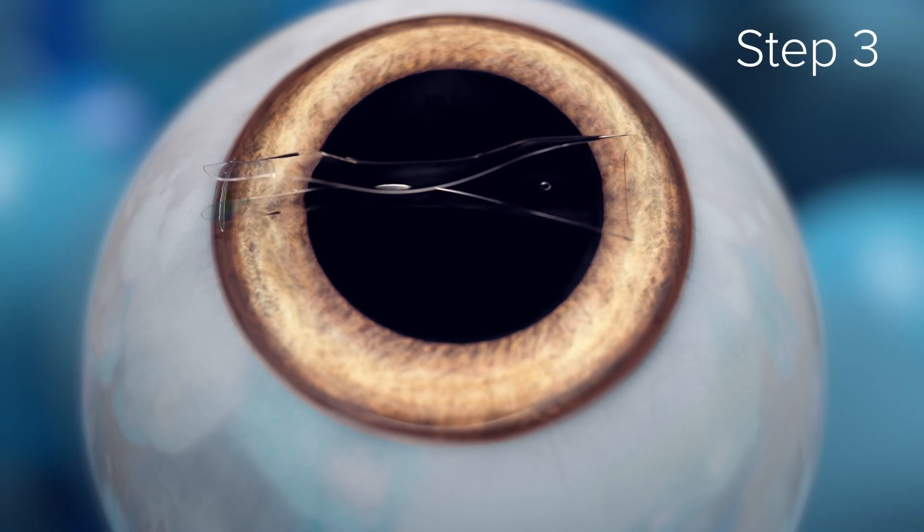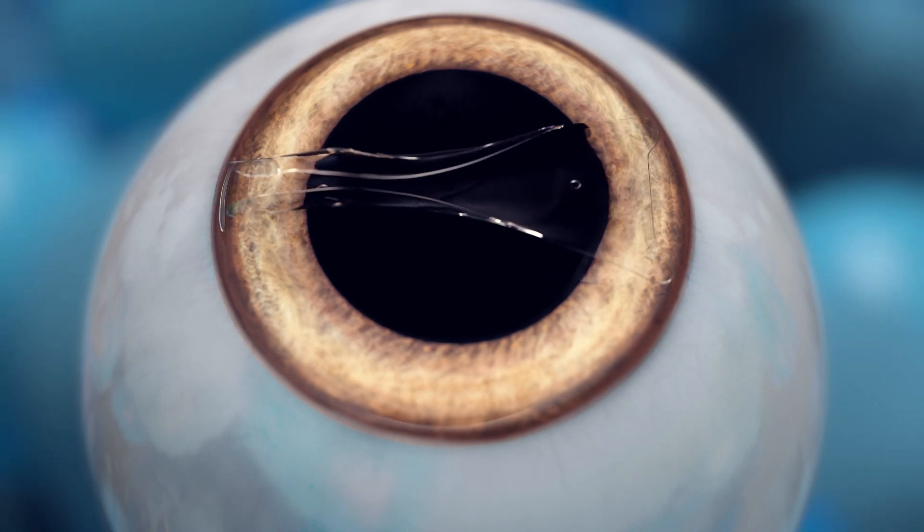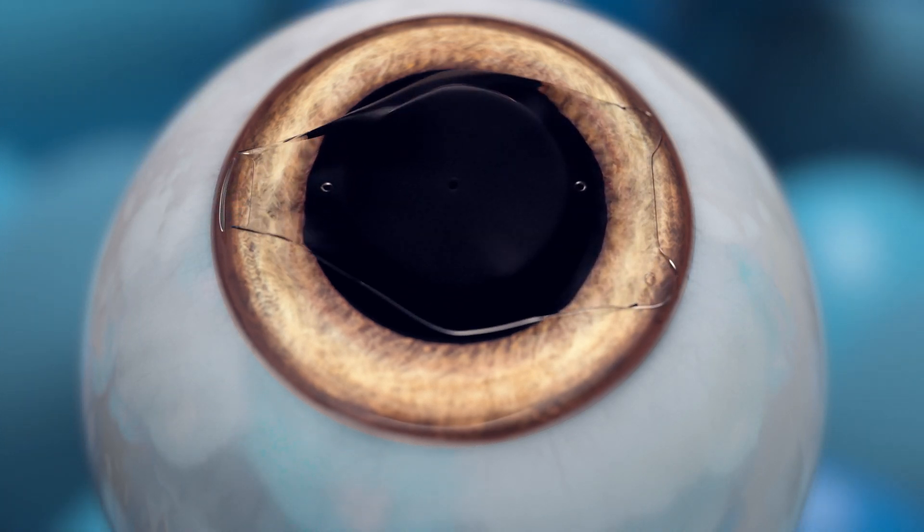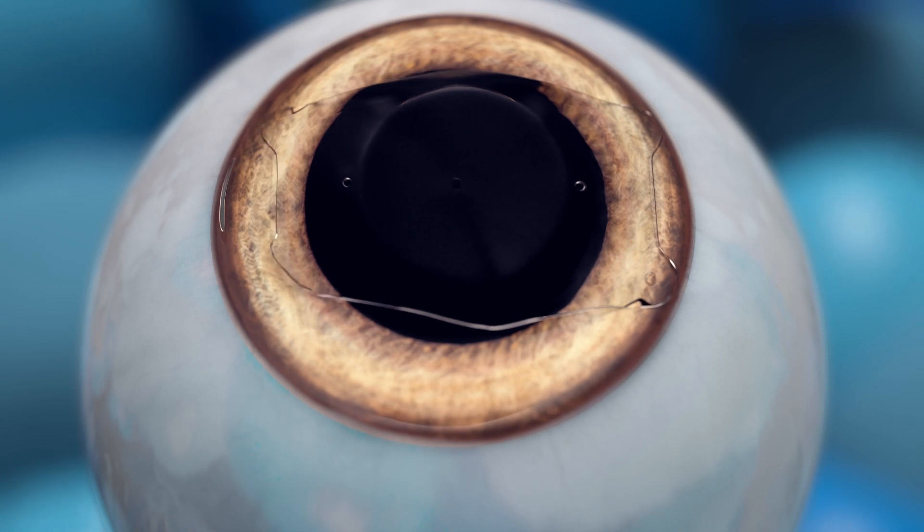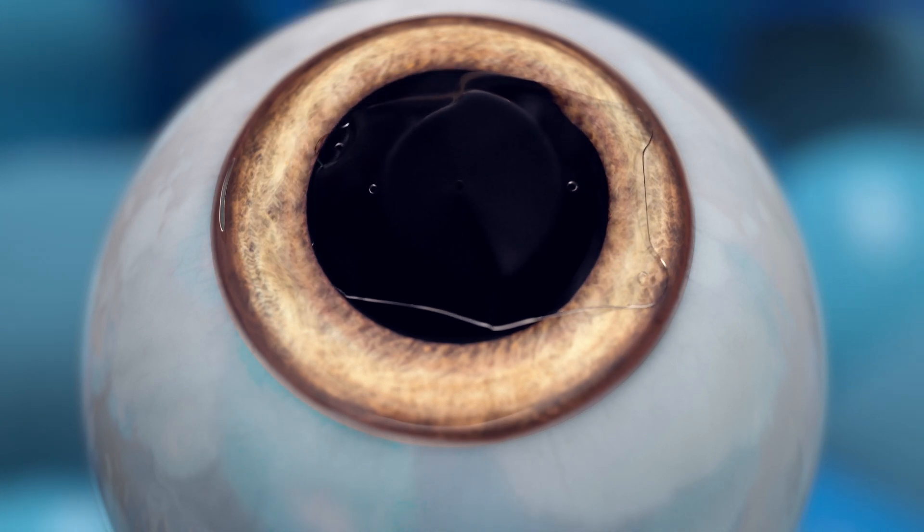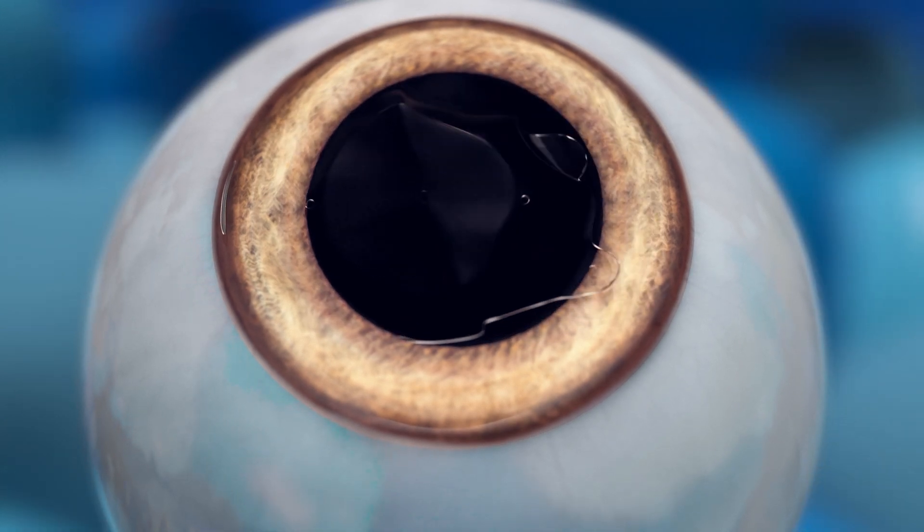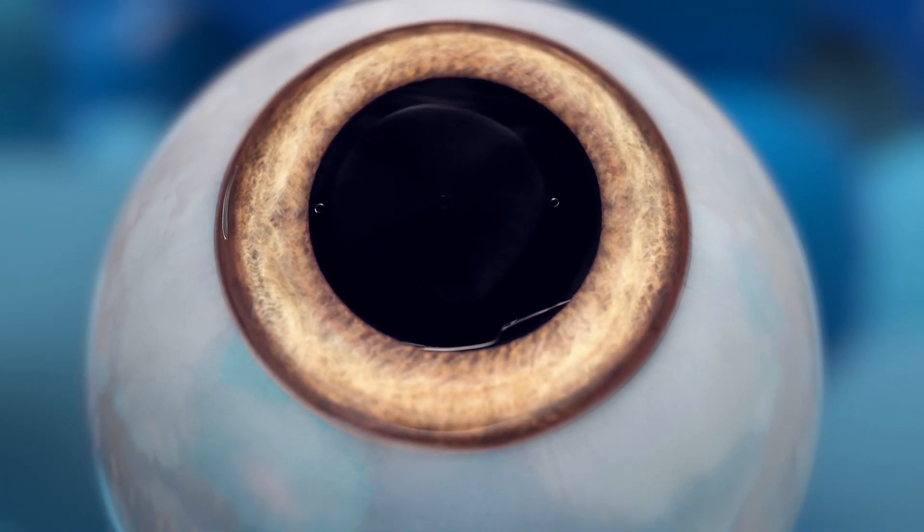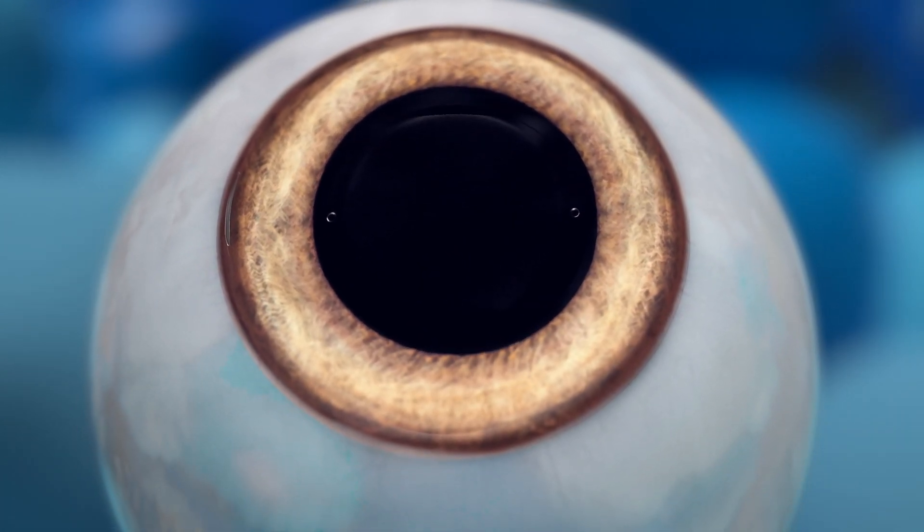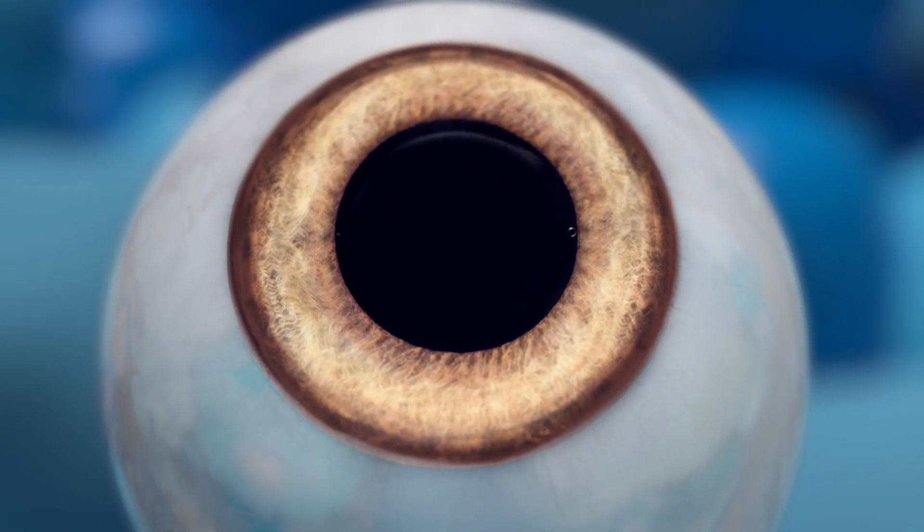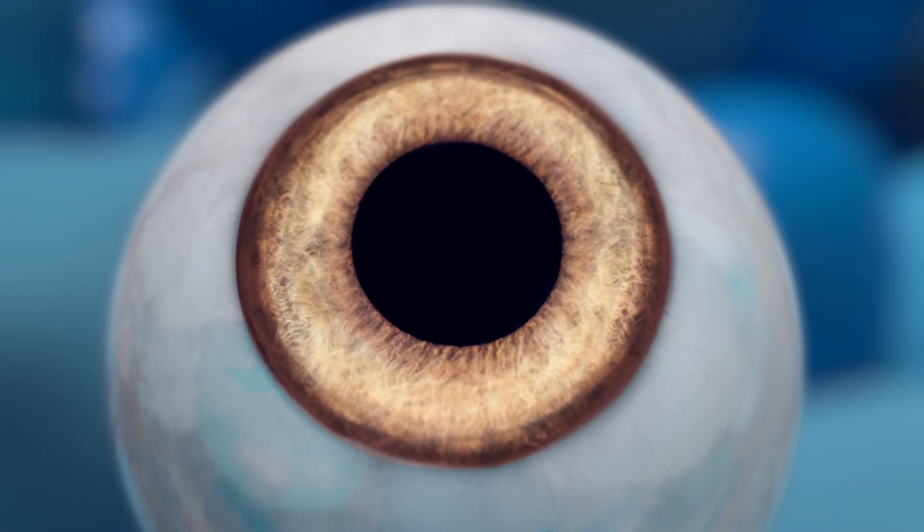Step three, once EVO is inserted, the doctor will make any necessary adjustments to ensure its proper positioning in the eye, securely placing it behind the iris, the colored part of your eye, and in front of the natural crystalline lens.